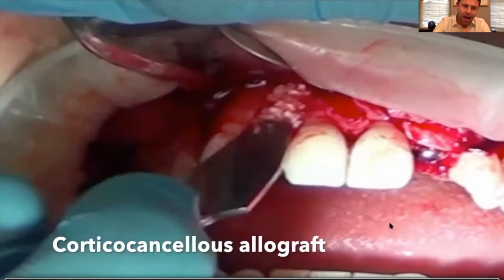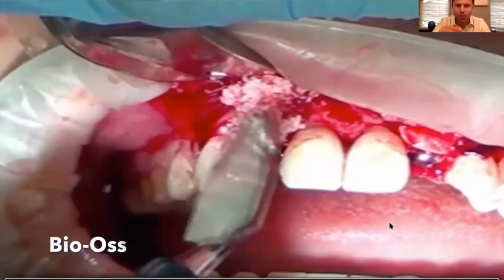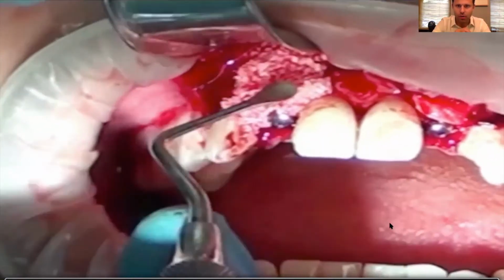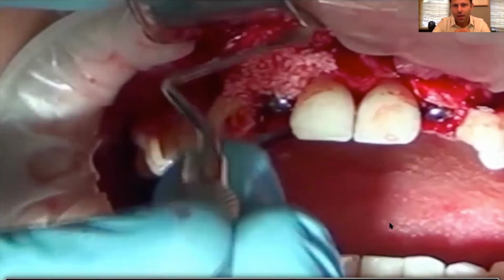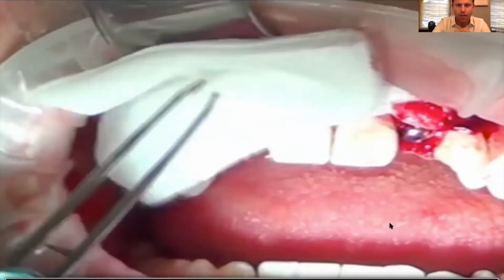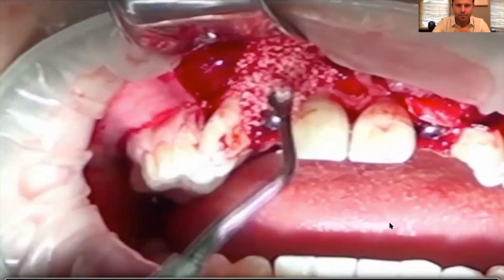On the opposite side, we had a fenestration. So we needed to place cortical bone first over the top of it, and then I packed it with BioOss, right after I placed cortical cancellous bone directly touching the implant. So we placed the exact amount of bone on both sides, packing it up really high towards the nasal cavity, as well as all around, and having a mound of bone around there. The key is just making sure that you have a lot of bone.